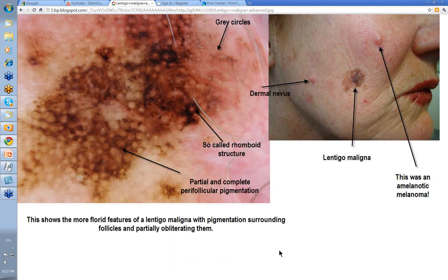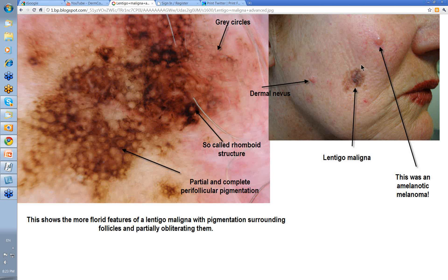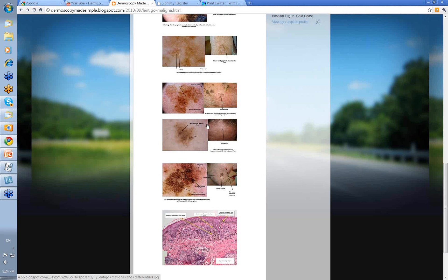Another one. This lesion was terribly obvious. You stick your dermatoscope on it — varying pigmentation, rhomboid structures, rhomboid structures, perifollicular pigmentation, accentuation around the pseudo-network — florid features of a lentigo maligna. However, there was this lesion up here. In point of fact, this was an amelanotic melanoma. I sent it to the plastic surgeon and said excise this. He said he'd excise this BCC up there as well, but when he excised it, it was an amelanotic melanoma. Always look around — if they've got one suspicious pigmented lesion, they may well have something else.